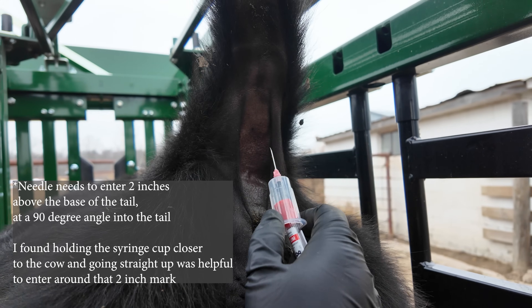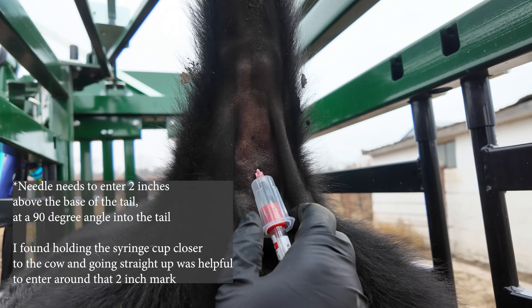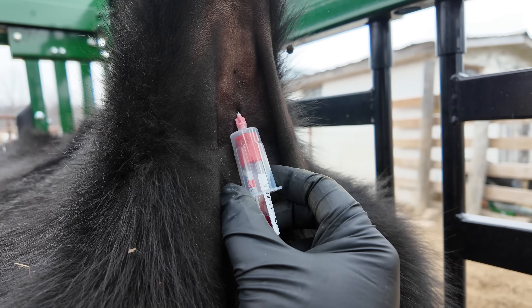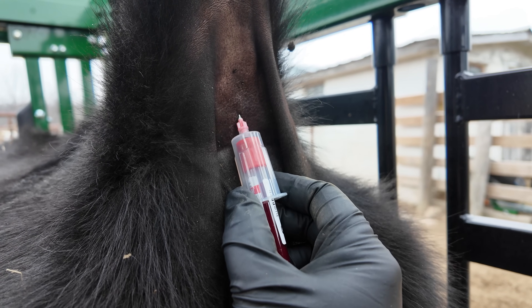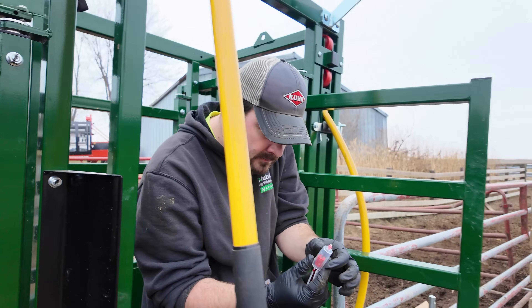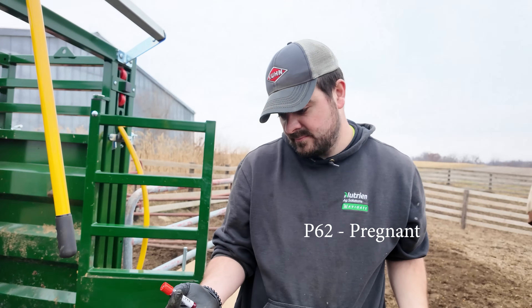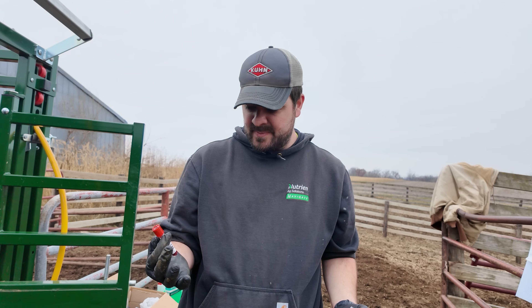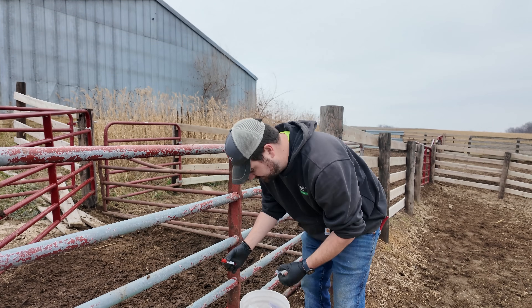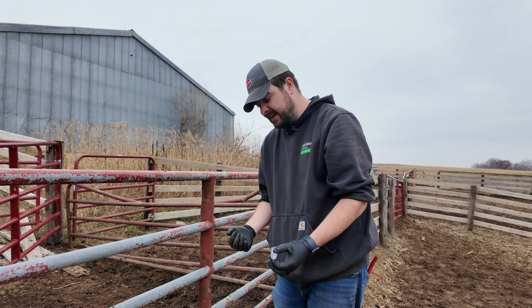She's nice and clean. As close to the base of the tail as possible at a 90-degree upward angle. Once we feel like we've gone in far enough and she's settled down, go ahead and puncture the vial. I had to adjust it around a little bit, but you can see the vial filling up. Once we've got a good amount — we only need two cc's worth — we can go ahead and pull out the needle and the vacuum tube. So there we've got our blood. This is going to get sent to a lab roughly 150 to 200 miles away, and we should have the results back within a couple of weeks. Not as immediate as having the vet do it, which personally is still my preferred way, and I'll probably still do that in the future, but this is a learning experience.